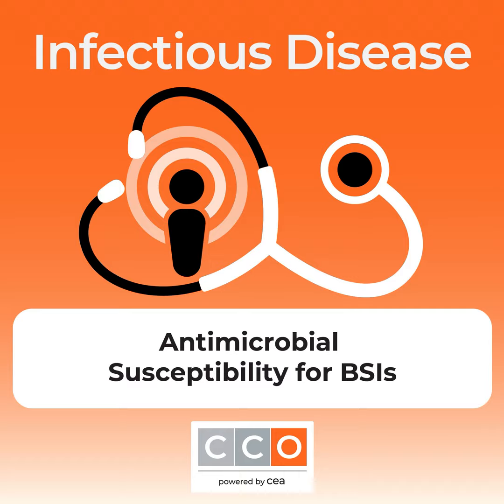So the trigger is an Enterobacterales with no resistant gene. We do a second screening for those 3% ESBL with ceftriaxone and ceftazidime. If it's detected, it's an ESBL, we don't do anything else. But if it's not detected, we are able to release antimicrobials that allow the clinician to de-escalate. Rapid PCR, the BCID, gives you the evidence to de-escalate.